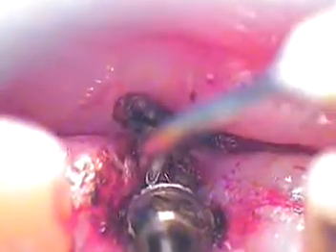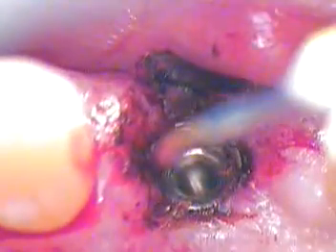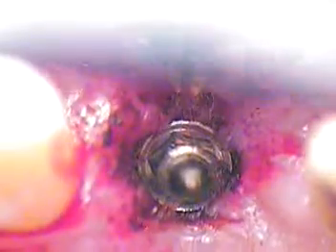Double checking my tip. I'm going to get a new tip. As I saw some debris come up, I want to just make sure I'm... Yep. All right, here we go. Perfect. That's looking real good. I can see the whole margins of the fixture itself, unimpeded. Perfect.